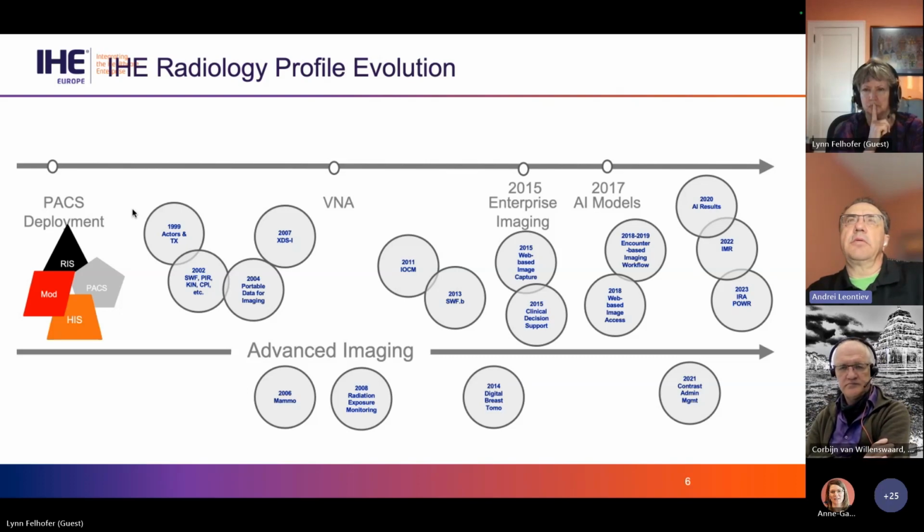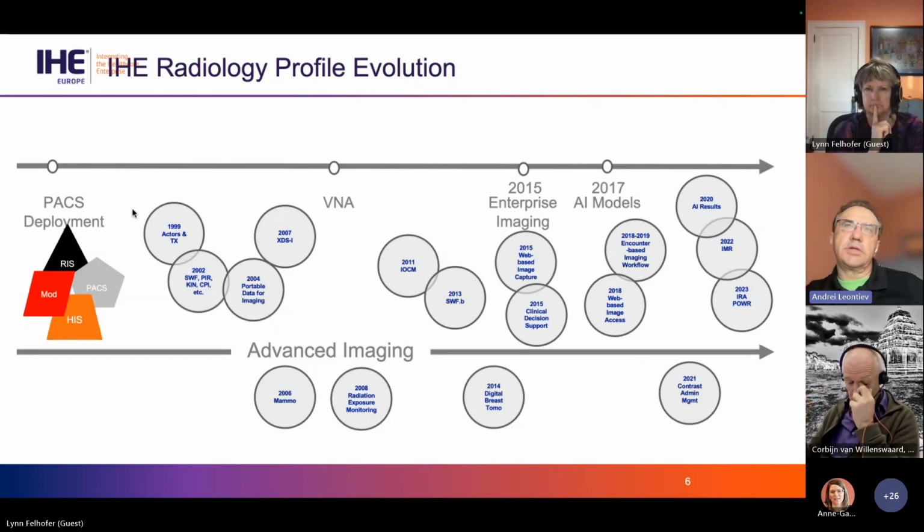If we look at the most recent introductions of profiles, the other big category that radiology is now looking at is the aspect of diagnostic imaging, how the diagnostic imaging reports could be created, populated, how their content could be managed, how different applications could collaborate in producing the standardized, well-structured and codified diagnostic report.